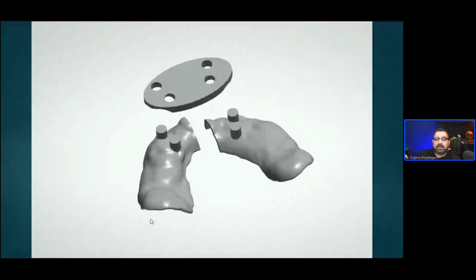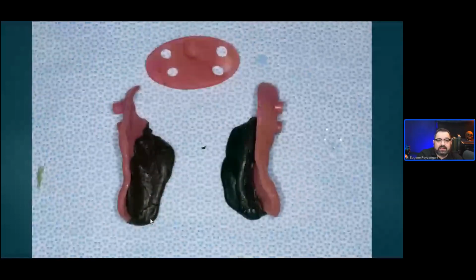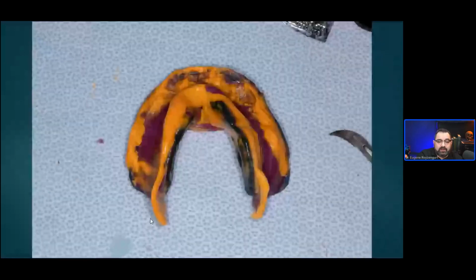I had a patient we were working on that has a severely limited mouth opening due to surgeries and cancer and everything else. So we had to create something that needed to be put in two pieces and then locked inside. This is what we did. So we printed a 3-piece custom tray that we locked inside the patient's mouth to take the impression.